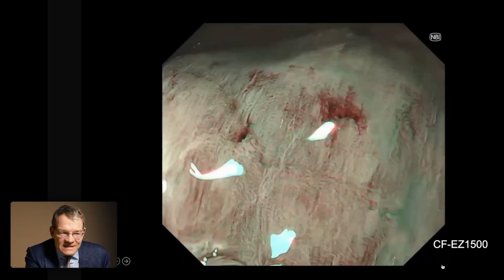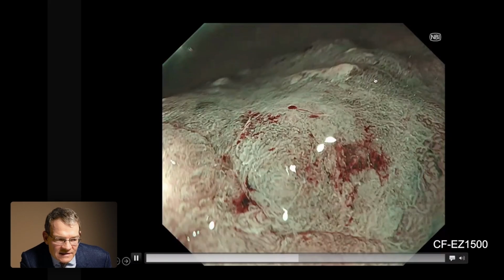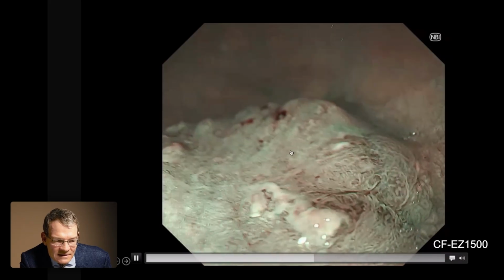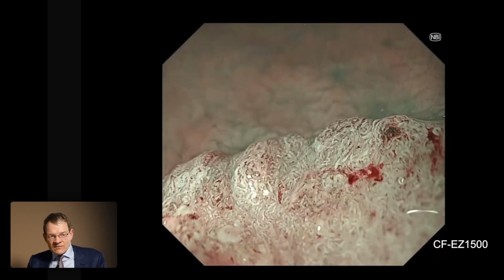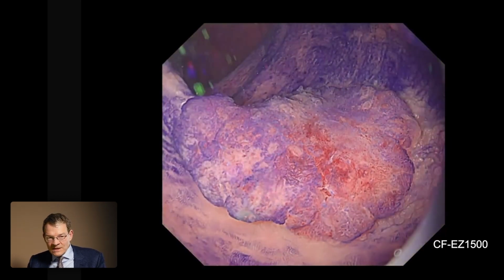more silver center of the lesion. This is also suspicious here for cancer. So the center is more silver than the surrounding. And you may nicely appreciate now with NBI these abnormal vessels. I think when we are using JNET, this is JNET type 3.